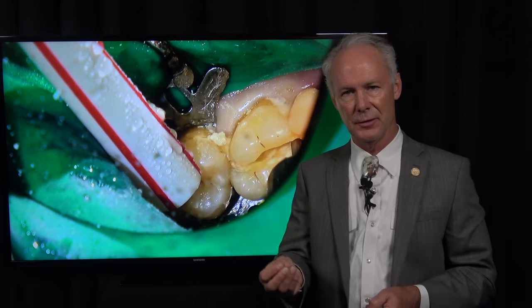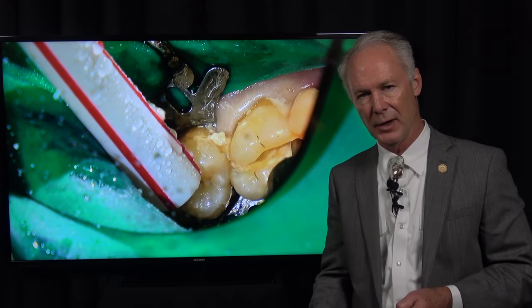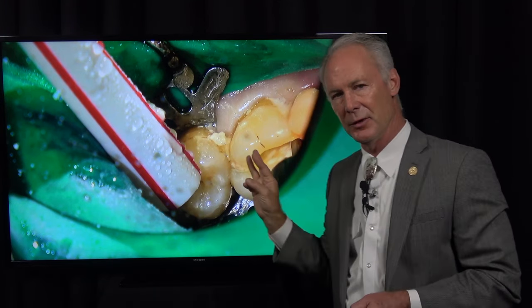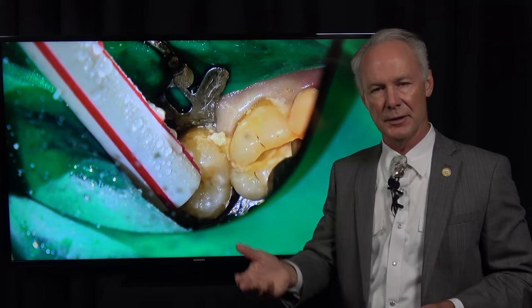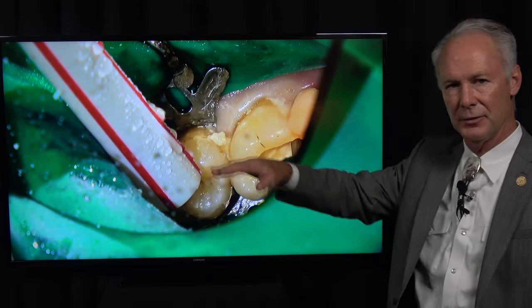Now if it's a single-rooted tooth, more times than not I'll try to extract the tooth straight away and place the implant at the time of extraction, because I've got that perfect osteotomy as a guide. But if it's a three-rooted tooth — a maxillary or mandibular molar — or oftentimes a two-rooted bicuspid, I'll graft the site, wait six months, and come back and place the implant once the bone has reformed.